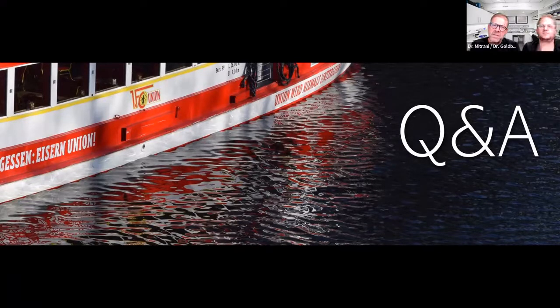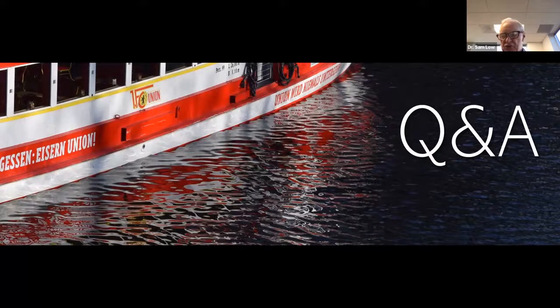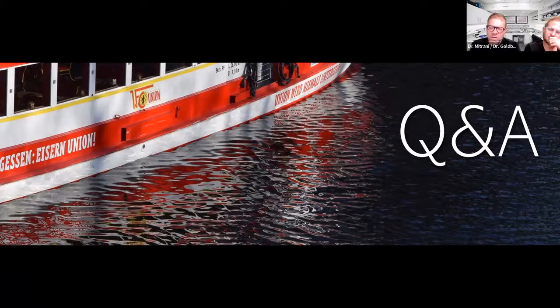So what happens if you? Well, the question is, can I hurt anything if I'm using the wrong parameters? Well, if you don't use the right potency, you're not going to be effective doing what you want to do. And so you want to make sure that your tip is adequate, and you want to make sure that your parameter is adequate. Otherwise, you won't be effective in the task that you want to do, whether removing the veneer or excising or cutting the tissue away, whether it's bone or soft tissue.